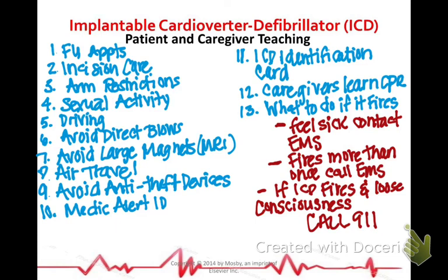And I would assume the person would be aware of this, where like the pacemaker, they don't feel it. Right, but when this fires to shock them, a lot of times they will feel it. Yes. Not so much pertaining to this, but I thought asystole was a non-shockable. All right.